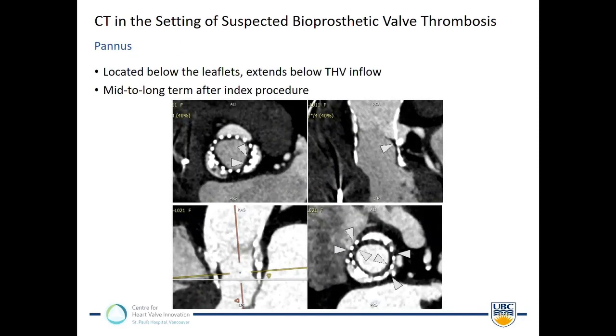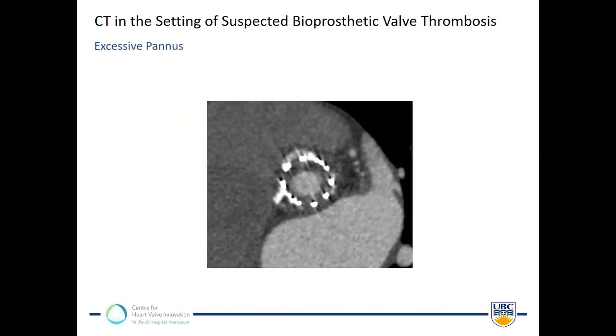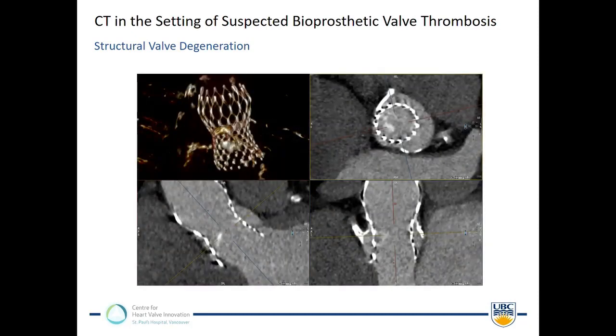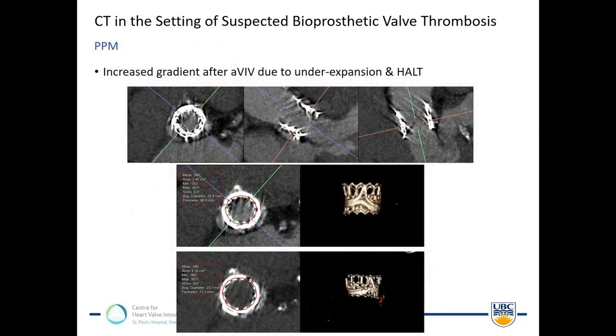Other reasons for abnormal findings, there are plenty. One is pannus. Pannus is usually distributed in a very circumferential fashion, and most importantly, it extends somewhat from the LVOT to the inflow of the leaflet. So it's actually pretty easy to differentiate pannus from leaflet thickening on CT. Here, an even more pronounced finding. Those patients may actually also show up with an increased gradient, and that's, I think, one of the benefits of CT, to really differentiate those different scenarios. Then, of course, structural valve degeneration, as shown here in a CoreValve case with calcification. And I think the other differential is patient-prosthesis mismatch.